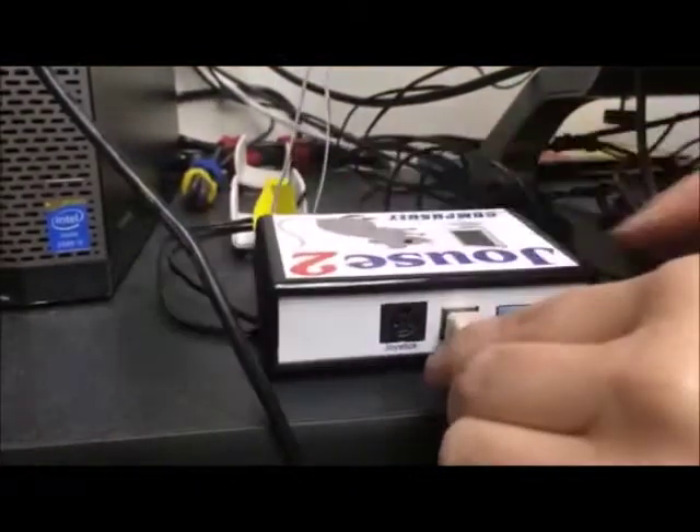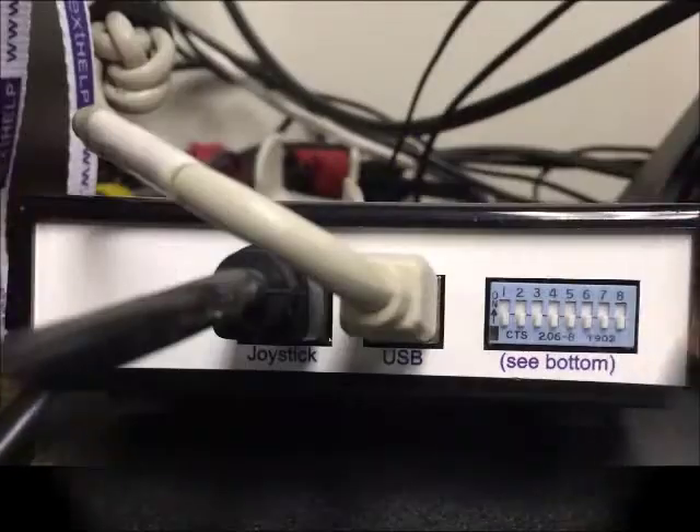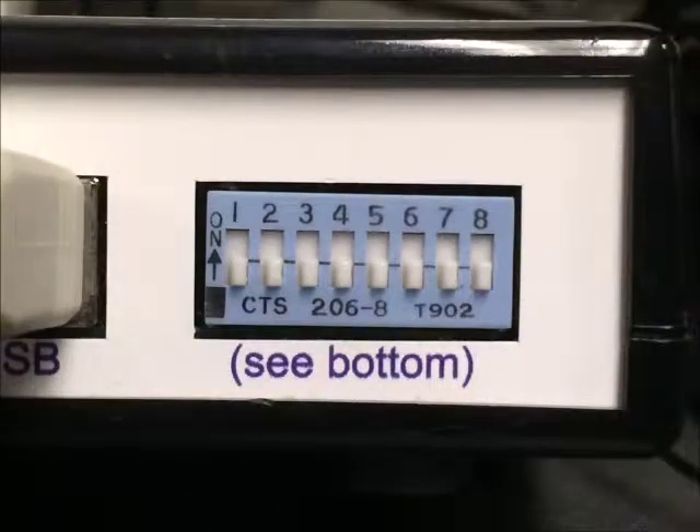Lastly, connect the cable from the joystick to the connector labeled joystick on the control unit. The Jouse2 replaces an ordinary mouse and provides this function right out of the box. There are additional advanced features that can be activated on the rear of the control unit if desired.